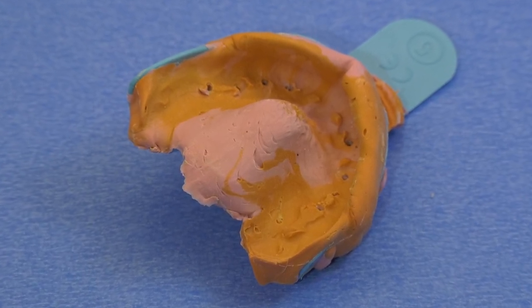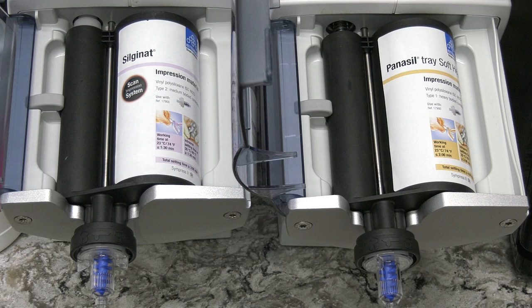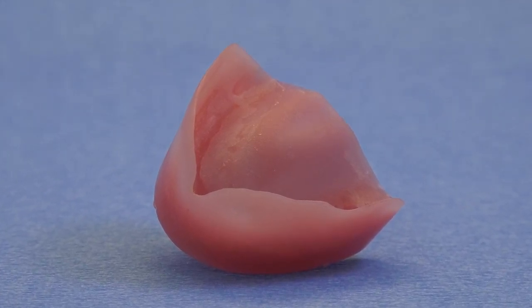Once the implants are in place and you know they're in good bone and solid, take a very good quality impression. I truly enjoy using the Kettenbach impression material — I started using it about six months ago and love it. It's very hydrophilic and gives almost a perfect impression every time. Digital impressions are also fine. Do not use alginate or alginate substitute; use a permanent polyvinyl or polyether impression material and take good quality impressions of the opposing arches.